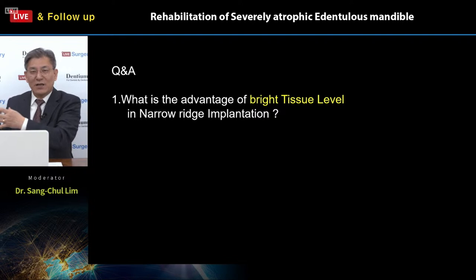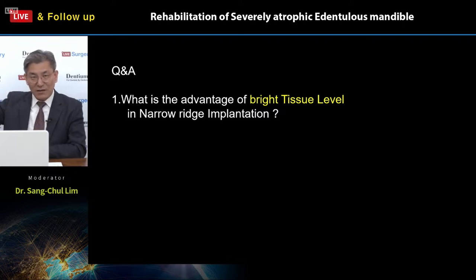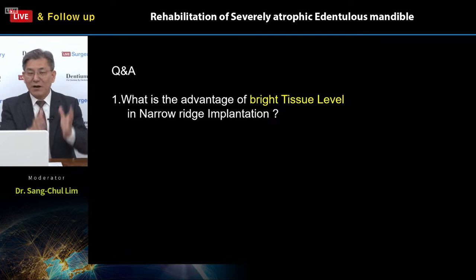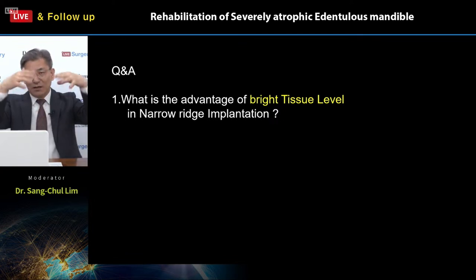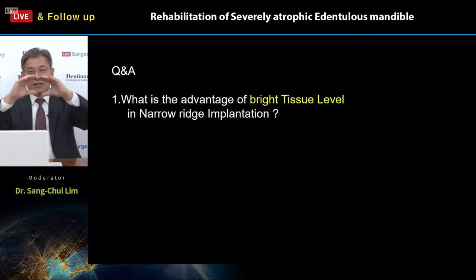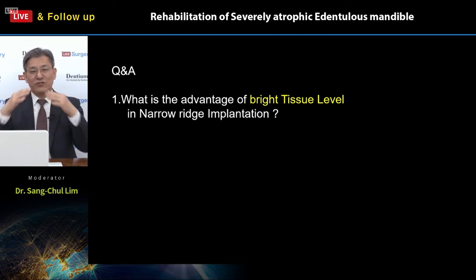Bone level is so risky because the wall is so thin, right? Because of the internal connection. However, this one is 3.5 diameter. The body is 3.5. However, the top portion, over the abutment level, the top portion of the fixture has a strong connection with the screw abutment. And also, the force distribution is totally different. The bone level is lower, and this tissue level is higher, almost at the ridge crest area. So first, force distribution. Number two, the viewpoint of the connection. So it makes it better and stronger compared to bone level.